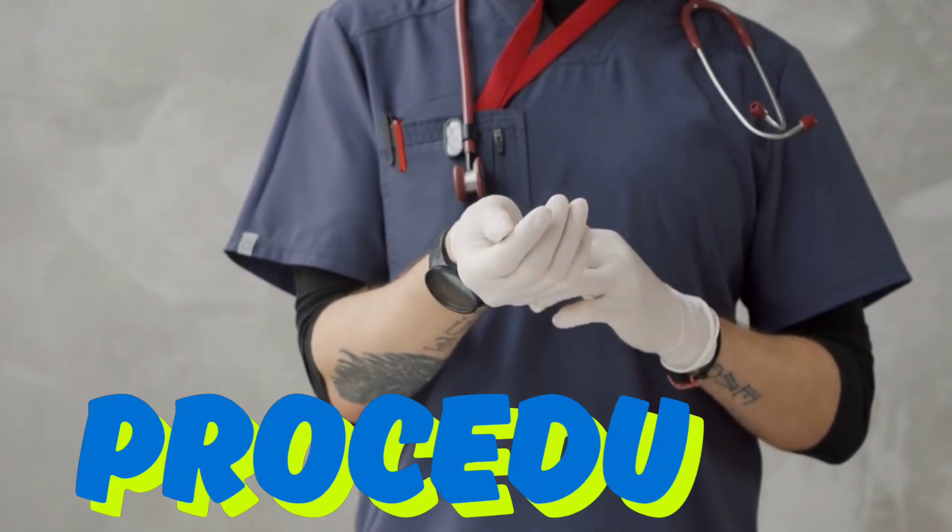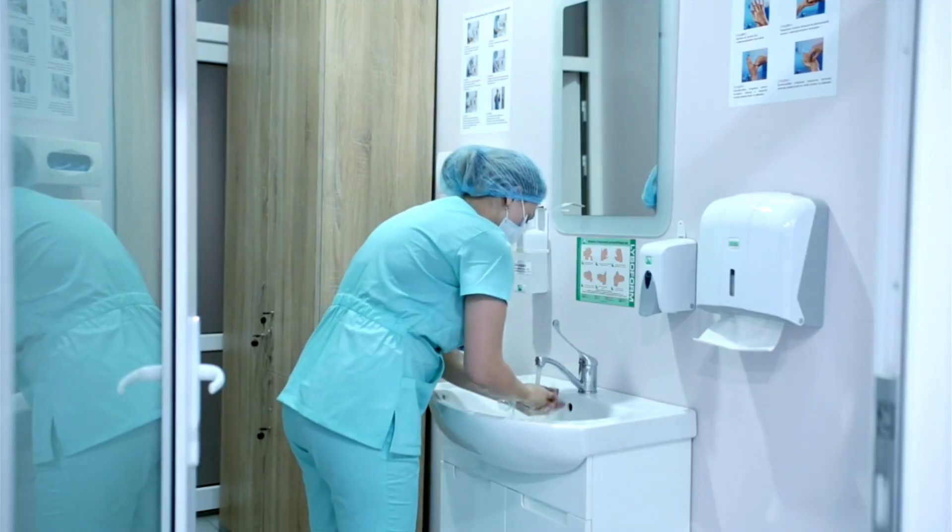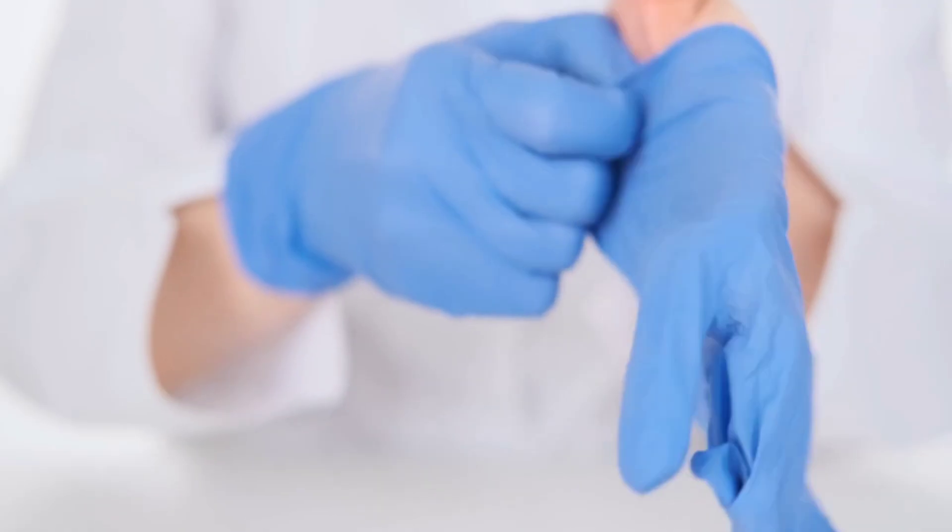Now let's go on to the step-by-step procedure. Step 1: Hand hygiene and PPE — wash hands and wear gloves using aseptic technique and gloving.